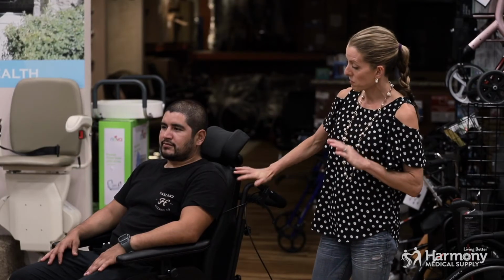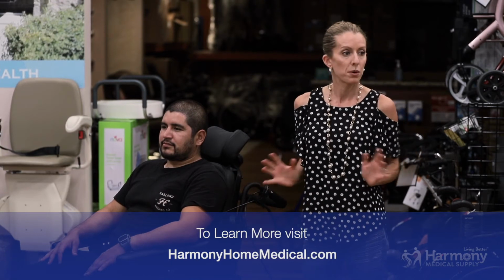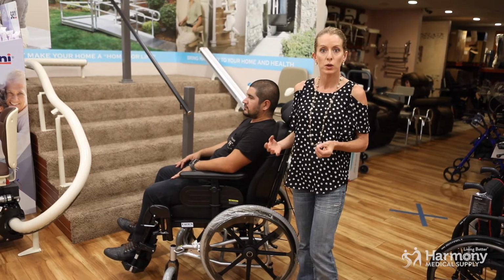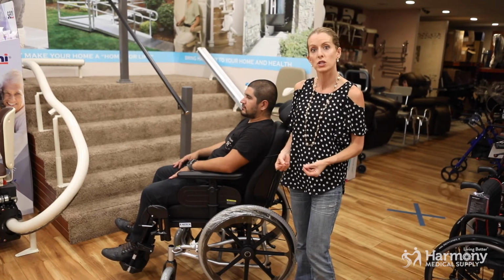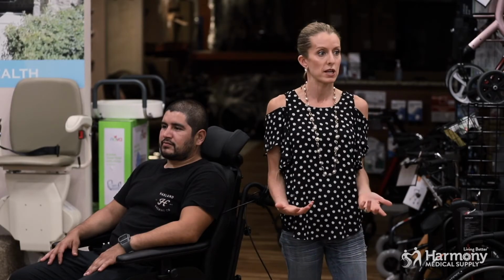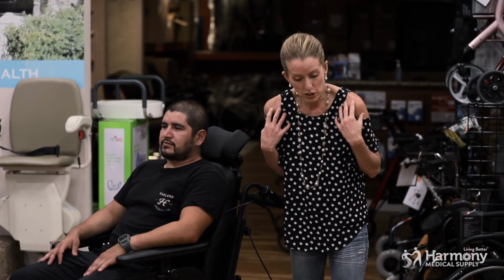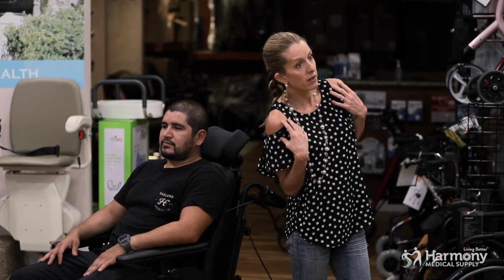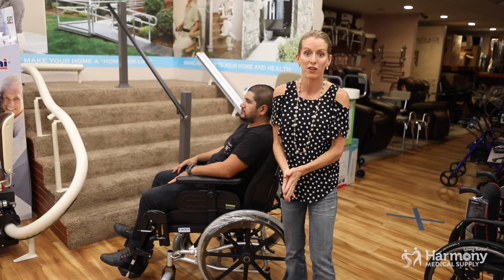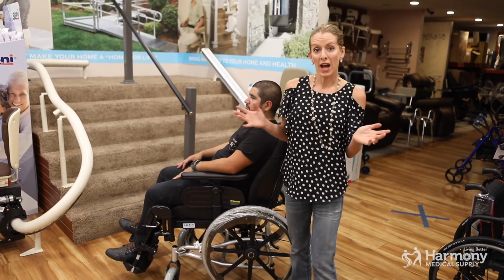They have aftermarket backrest and cushion options, meaning you can order the chair frame and put on any sort of backrest measured specifically for that person, with lateral supports, with any sort of harness or belts you need to support someone sitting upright in their chair, and to keep their posture as healthy as possible. Flexible and upright, not getting fixed postures like a kyphosis or shortening of the trunk. So proper wheelchair seating is everything, and the Tilt-In-Space Recliner can really help us do that in a very effective way. So I hope that was helpful.